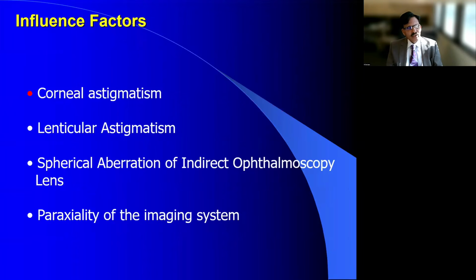That means we have what we call dynamic ophthalmoscopy. A tilt of 1 millimeter of your lens to one side increases the area of your viewing, the area you're working in, by at least another 10 degrees. And this becomes important in certain situations where you're compromised by the size of your pupil.